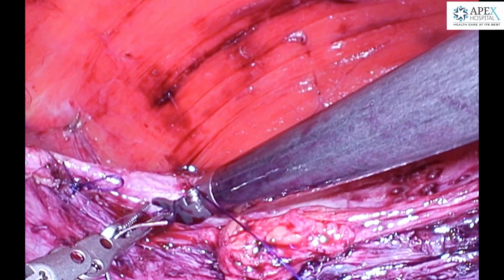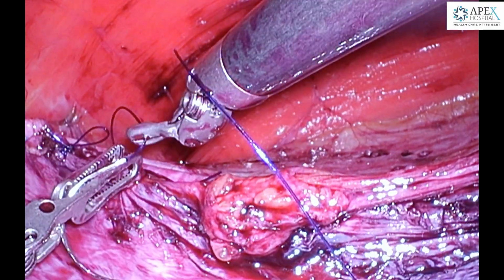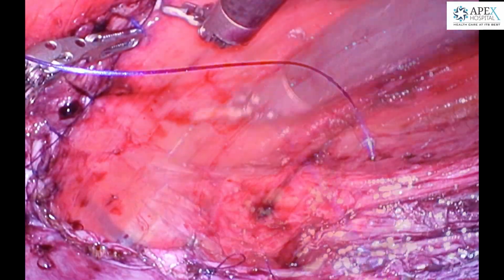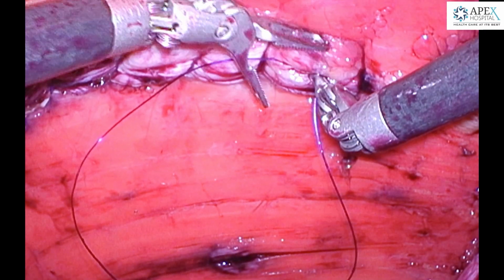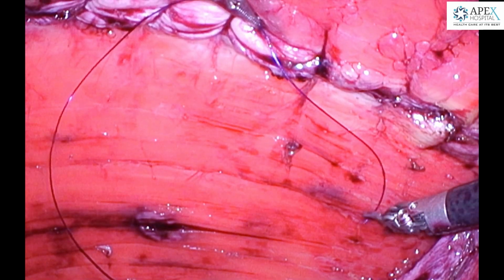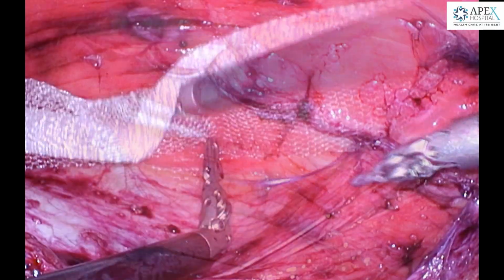Once complete closure of all peritoneal rents is done, a suture is introduced inside to measure the length of the mesh that will be required to cover the entire area. This is a 20 centimeter suture which we can see is seen to completely measure the area for reinforcement.